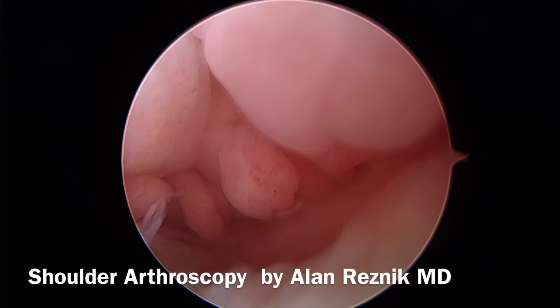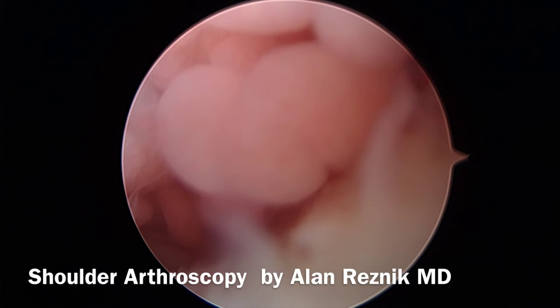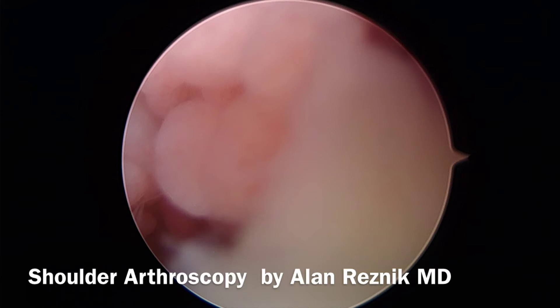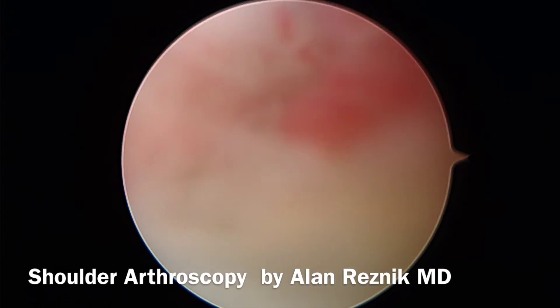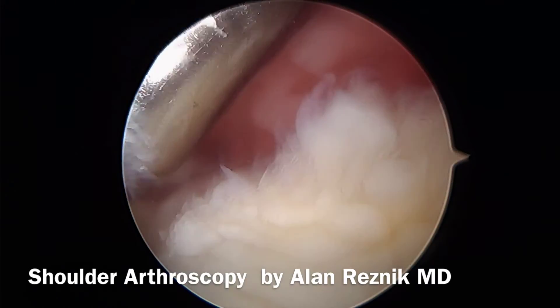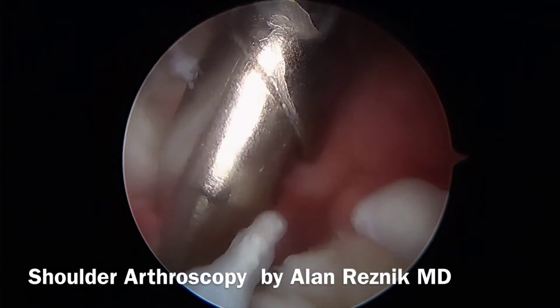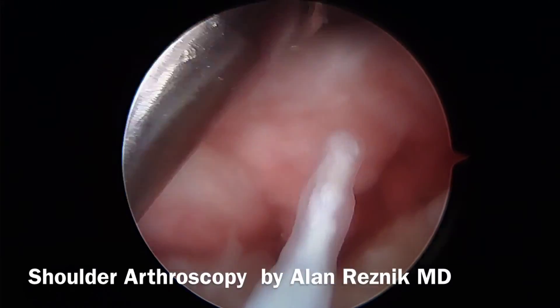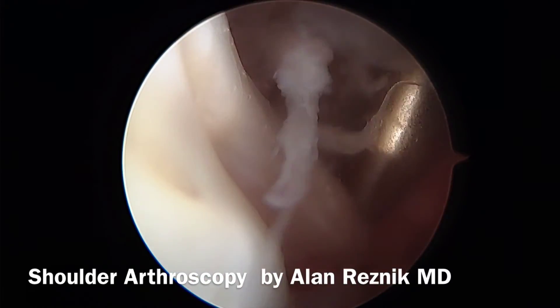One of the ways we can confirm that is to get a small cannula, and through a lateral portal in the subacromial space, if we apply the cannula — if there's no tear in the cuff, we wouldn't be able to enter the glenohumeral joint. But if there is a tear, and you can see it there, there's the gap. There's a full thickness tear of the rotator cuff. We're looking at the undersurface of it here.